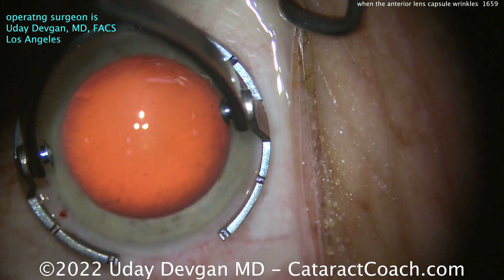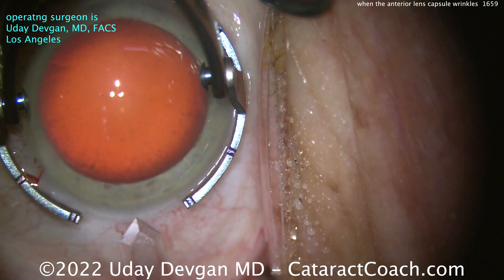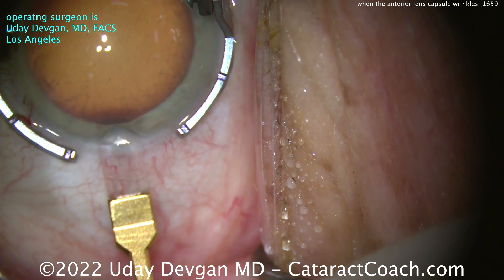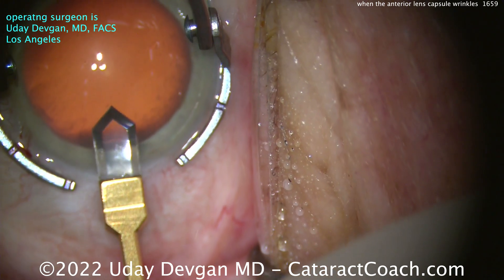We'll make our main incision here using a diamond keratome — a 2.2mm phaco incision at the temporal limbo vessels. That goes inside pretty easily. Nice tunnel length.